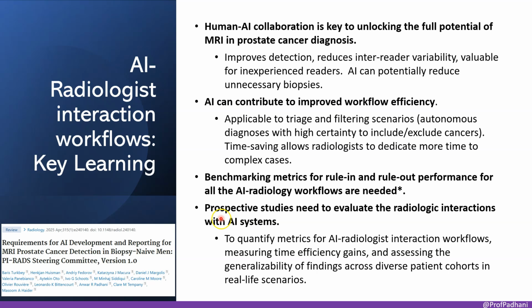cases. Third, we urgently need robust benchmarking metrics for both rule-in and rule-out performance, specifically tailored to evaluate these different AI radiology workflows, not just standalone AI. Finally, more prospective studies are essential to evaluate the real-world radiologic interactions with diverse AI systems, quantify any time or efficiency gains, and assess the generalizability of findings across different patient cohorts and clinical settings.